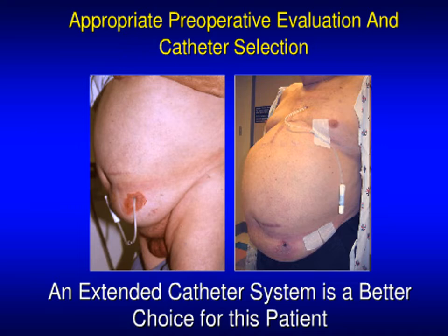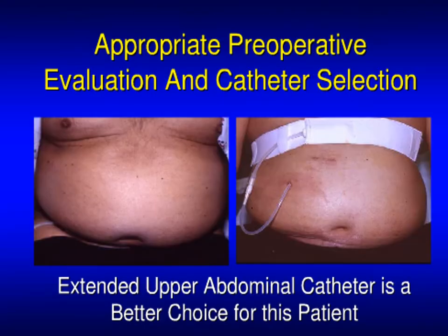I skipped that one, because if we have a patient with morbid obesity, stomas, we can use a pre-sternal extension. We can see here that in this patient, we had to change the site of the catheter from the lower abdomen because of the ulcers, as the exit site comes into the skin folds here. So we had to remove the catheter and we put it pre-sternal. See, it comes out from the front of the chest of the patient.